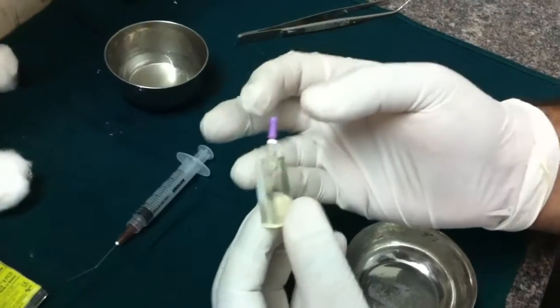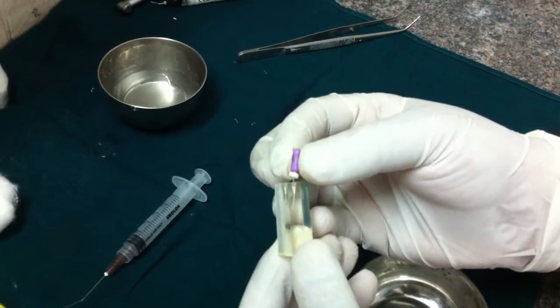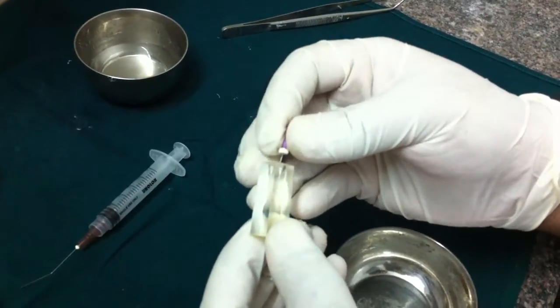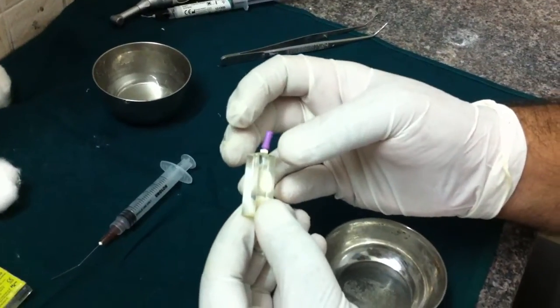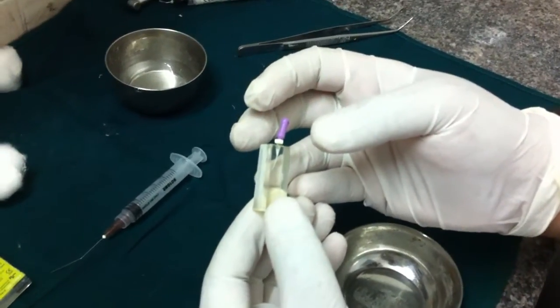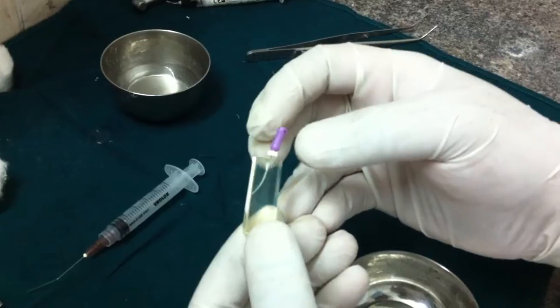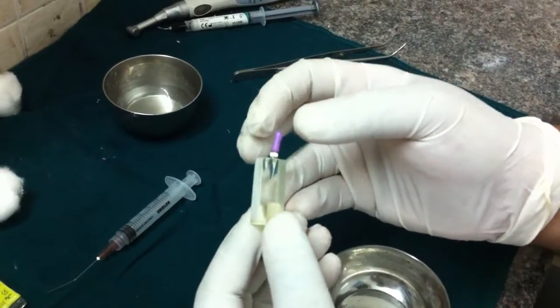I introduce the 10 size K file with gentle watch winding motion. Go and reach the apex. 0.5 to 1 mm beyond the apex is not an issue because the average diameter of the apical foramen is about 0.25 mm, whereas the tip size of the 10 size instrument is 0.1 mm. So you will not be tearing the apical foramen or be enlarging it inadvertently.